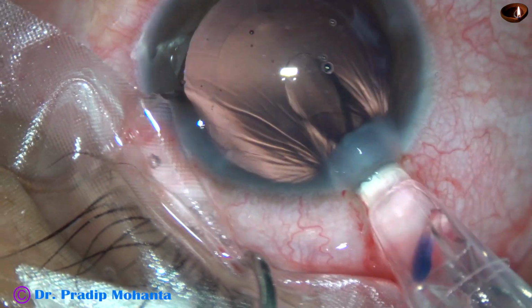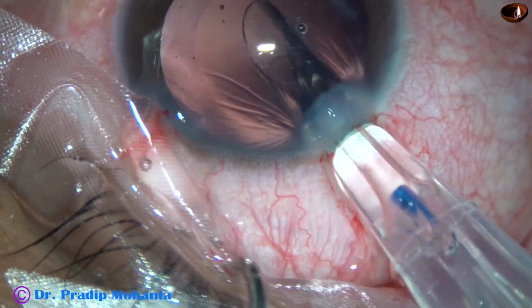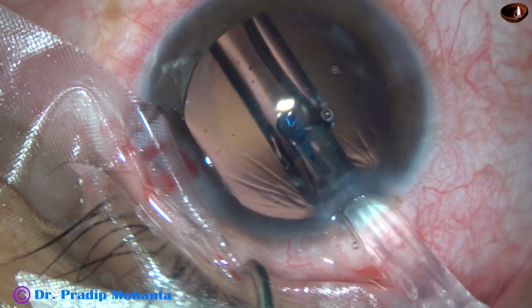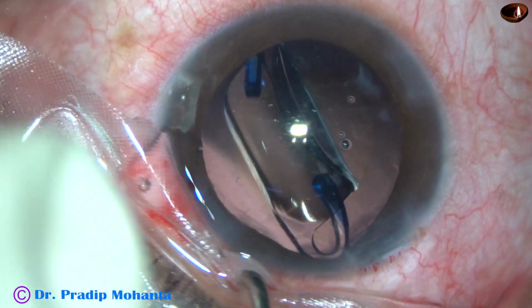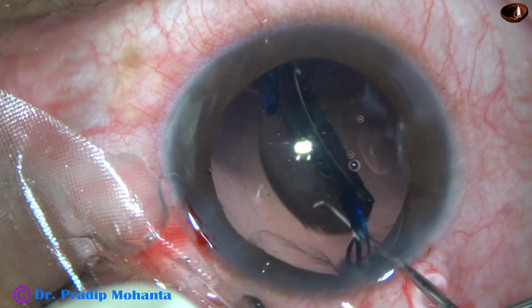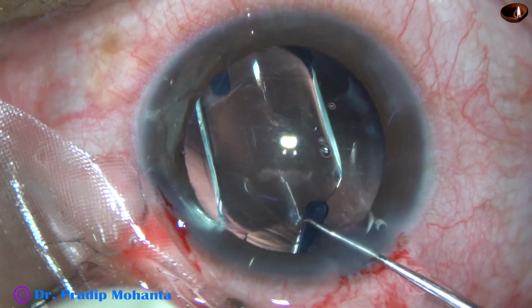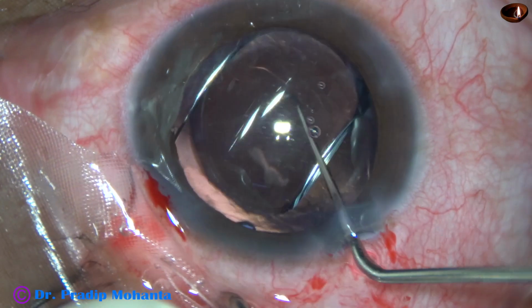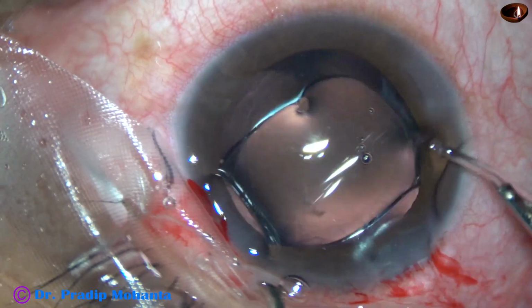And there is a screw device. Hold the cartridge with the left hand, screw with the right hand, and the lens goes into the capsular bag. In this case, the leading haptic has gone into the capsular bag. The trailing haptic is still not in the bag, so I use a Sinskey hook, press the trailing haptic, and it goes into the capsular bag. And now the lens is in the capsular bag. It is oriented in this direction. The haptics are at 2 o'clock and 8 o'clock.